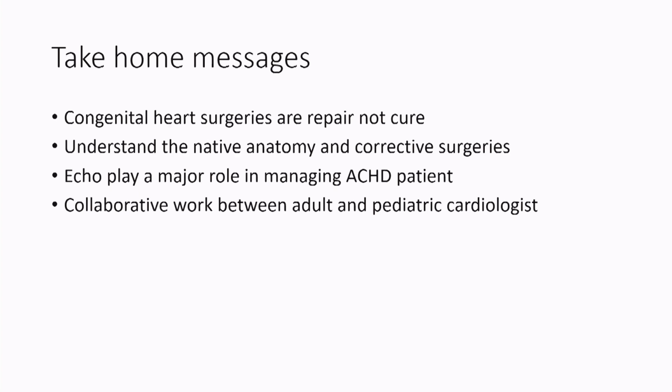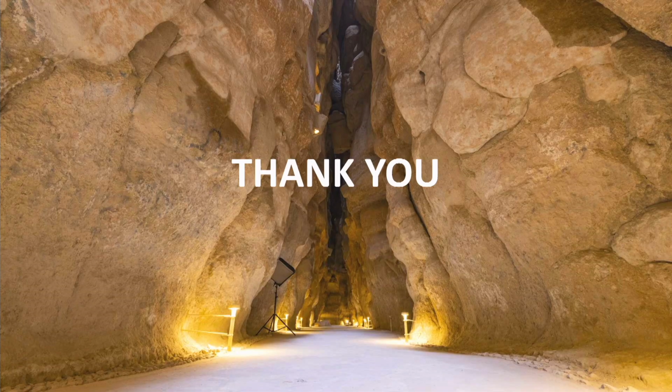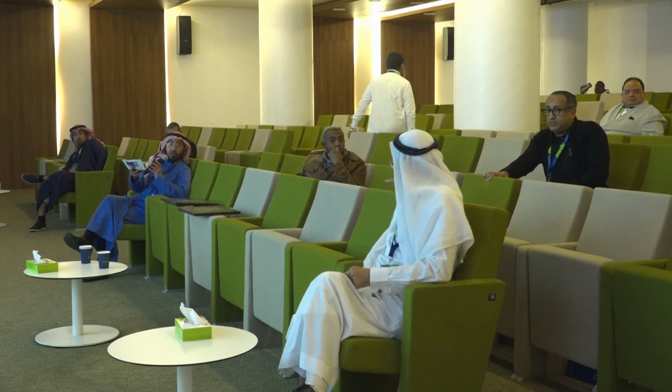I'd like to thank all speakers for beautiful talks, and very specifically the last talk. My question goes to Professor Muhammad Ayman. The point of care, I don't think this is addressed for cardiologists, right? We are trying to let non-cardiologists get partial training in doing quick echo.